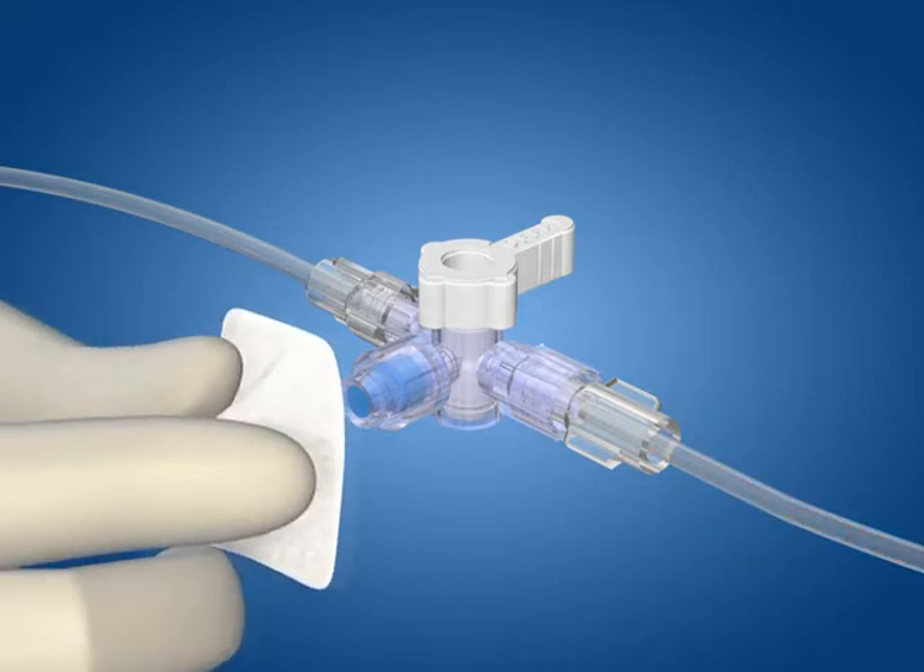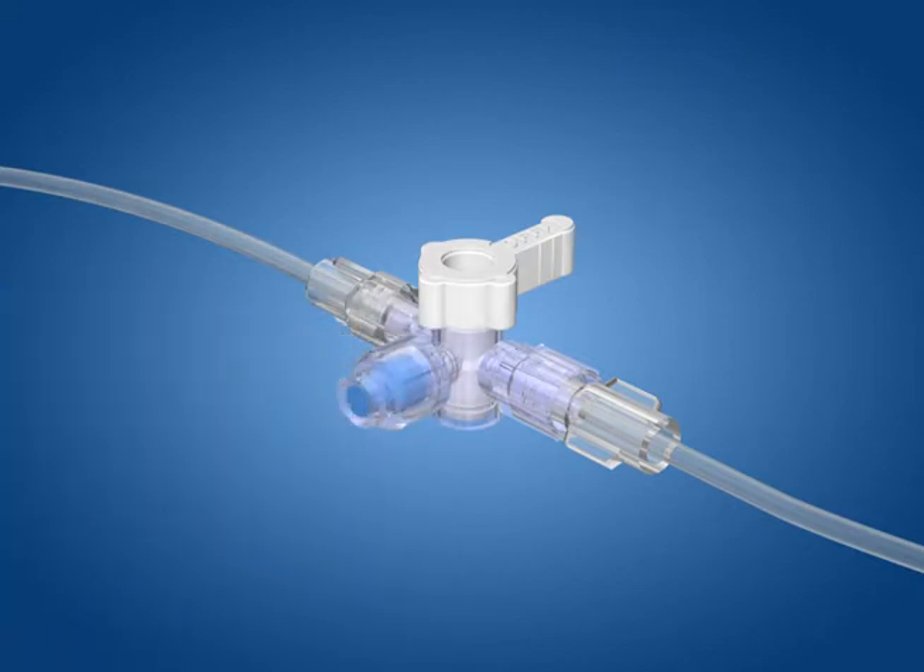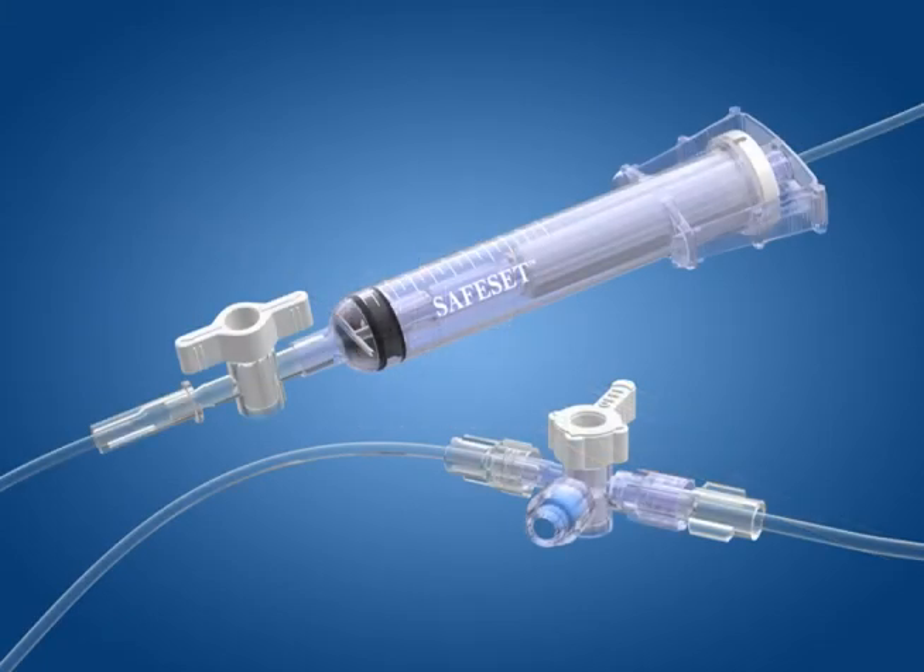When the procedure is complete, swab the valve again and turn the handle so that it is oriented towards the valve. The SafeSet with the new swappable valve is the simplest way to obtain a clean blood sample while eliminating blood waste and exposure.